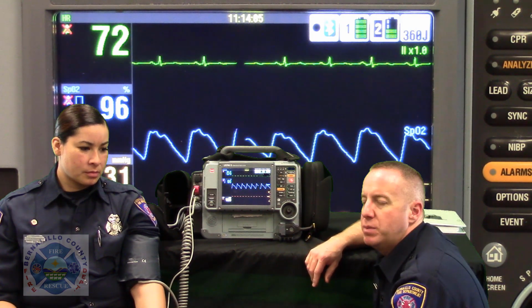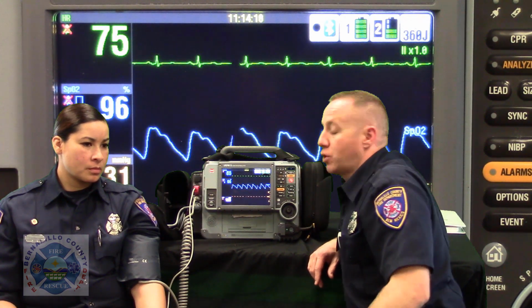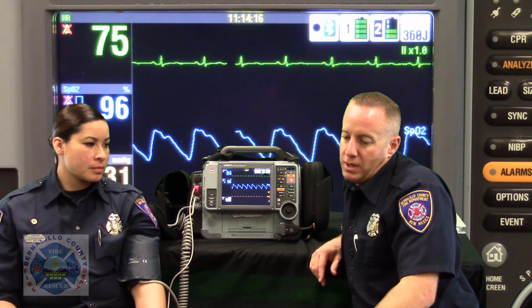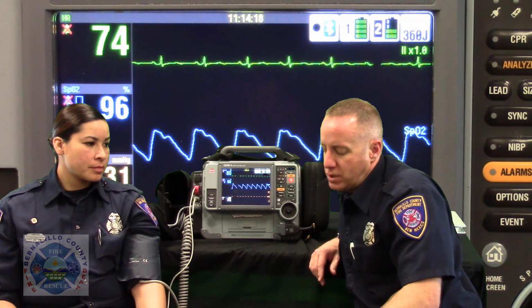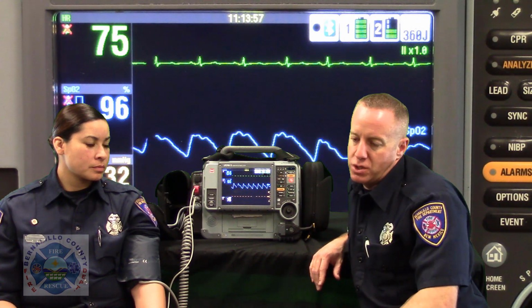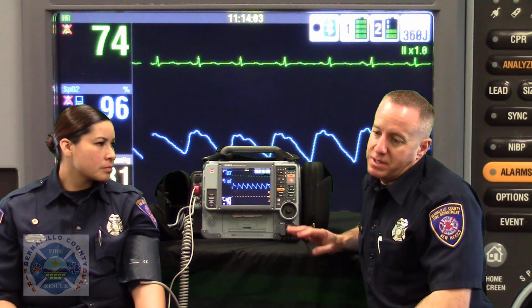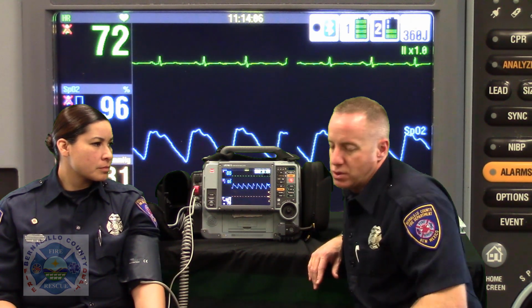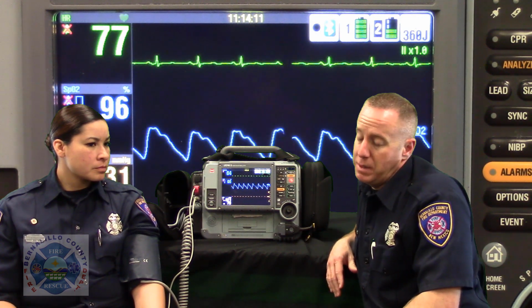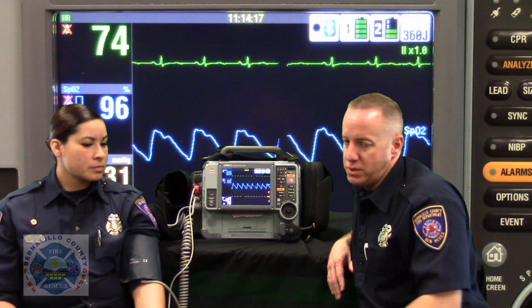Now, when would this be a wonderful tool for us to have in patients of a critical nature? So perhaps you just ran a patient that's in shock, or just return of spontaneous circulation after a code blue scenario, and you're trying to alter the blood pressure or maintain what you've got before you load them and go to the hospital. This would be a great time to set up an interval on the patient and make sure that you're watching that blood pressure closely. It also takes all the guesswork out of it. If you want to check that BP every 2 minutes while you're making your medication adjustments to epi drips or levofed drips, this sort of helps you take the guesswork out of it.